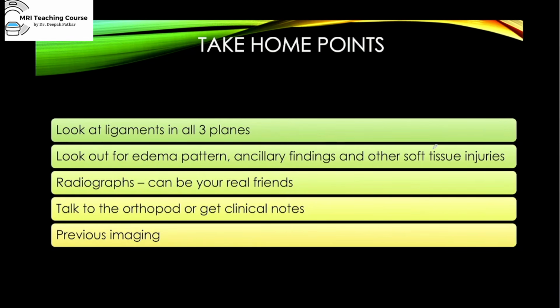Talk to the orthopod. If you're stuck, you don't know whether this is still mucoid or partially remodeled, just call up and ask the patient, did you have an injury before? Or talk to the orthopedic surgeon, is the patient having ligament laxity? And look at the previous imaging.